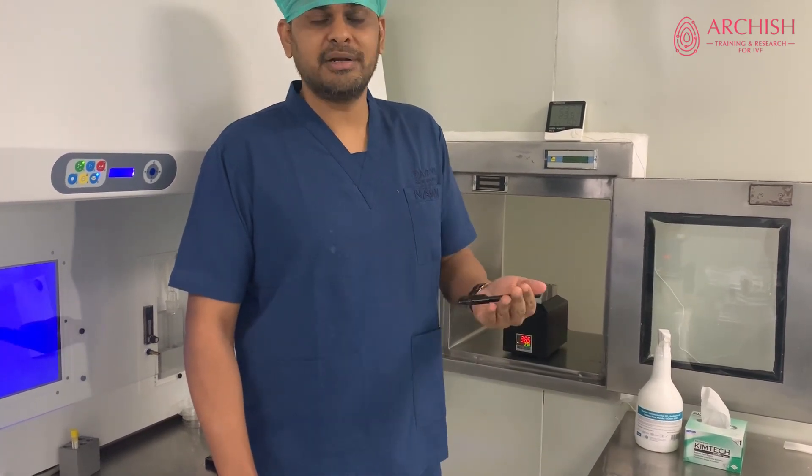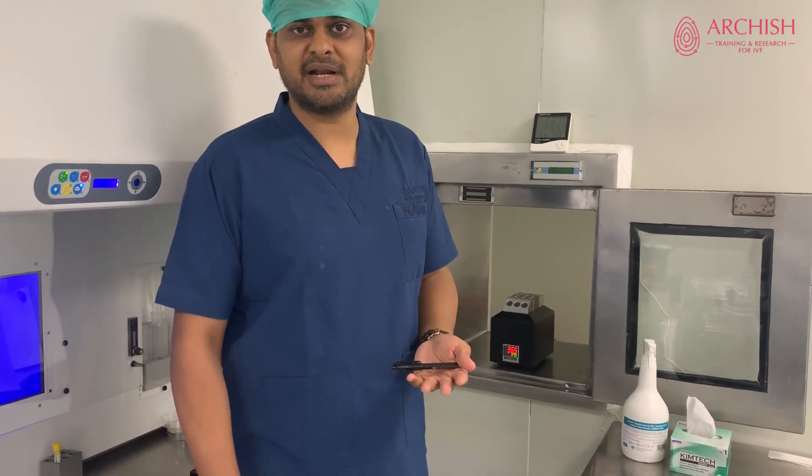What do you need for taking care of these instruments? The two most important instruments you need are the temperature probe and the CO2 analyzer. These two instruments are pretty much the cornerstone of every laboratory, and I'm sure all laboratories must have them. If not, please buy them immediately — you don't know what is going wrong in your lab, and that's particularly one reason why you're stuck at a particular result or success rate, or wondering why your results are deteriorating.